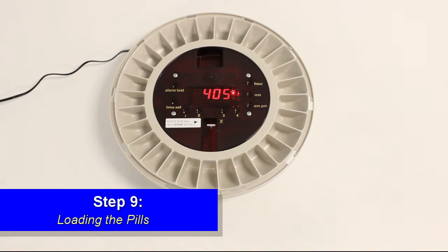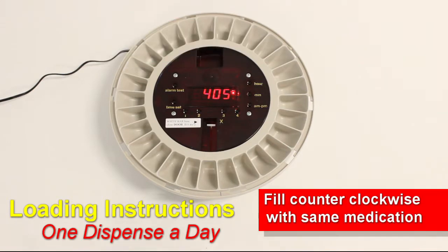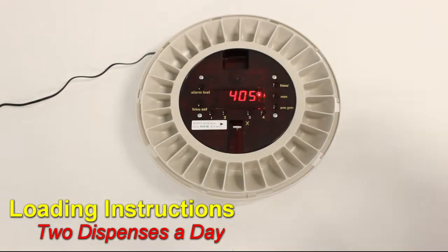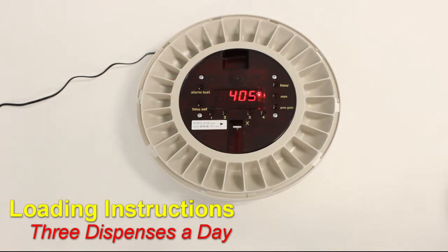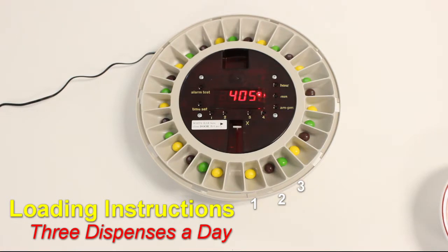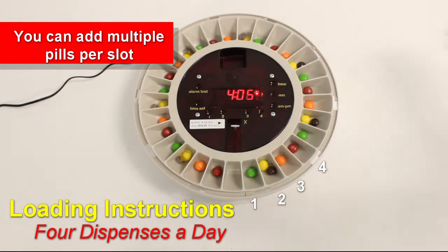Step 9: Loading the pills. Start by inserting your medication in the slot to the right of the white bar. Fill counterclockwise until full. For one dispense each day, fill each slot with the same medication. For two dispenses a day, start one slot to the right of the white bar and alternate between the medications until full. For three dispenses a day, start one slot to the right of the white bar, fill the first slot with the first medication, the second with the second medication, and so forth until full. For four dispenses a day, do the same as three dispenses, only with an additional slot filled.